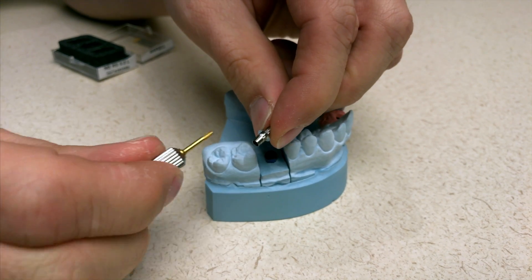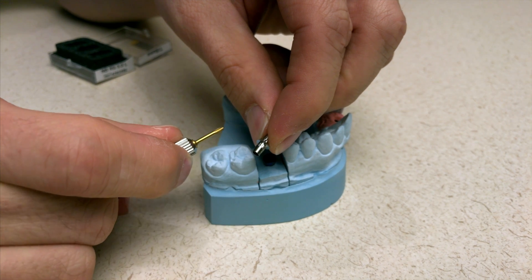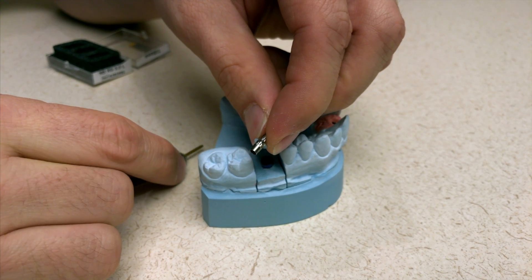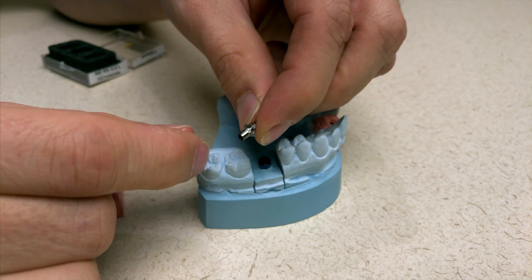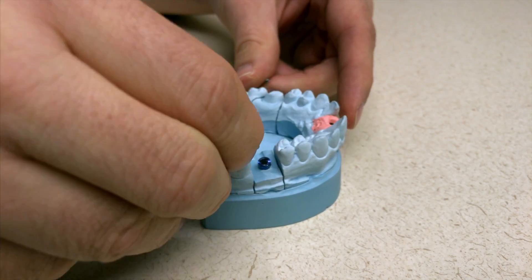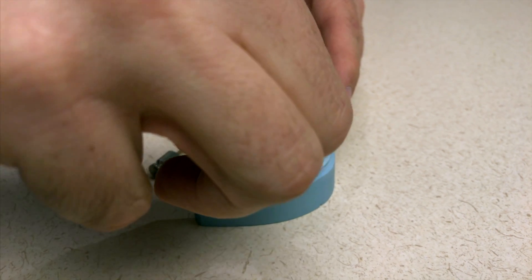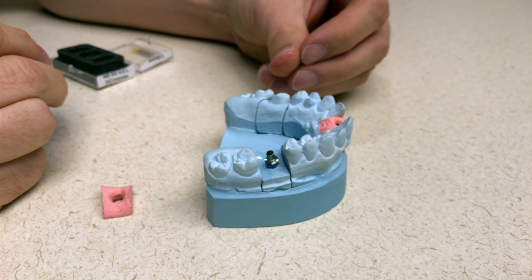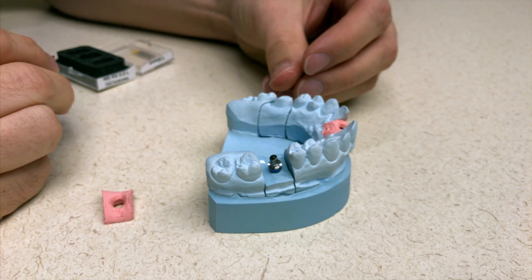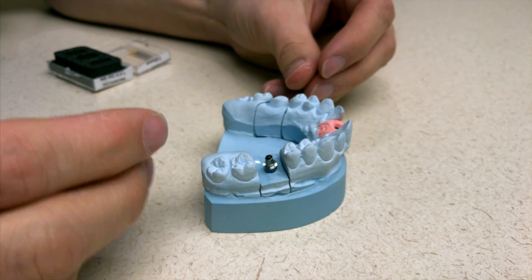It's hard to see on the screen, but there's a little positive bleb or a little outcropping that's going to indicate how to put the scan body on and orientate it correctly. I'm going to go ahead and put it into the tri-lobe connection — just turn it until it slides down appropriately onto the platform. And what I'm looking for is where that little sleeve outcropping is, and it's right there.